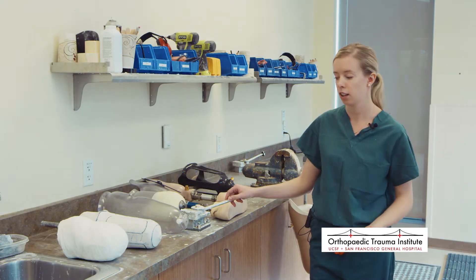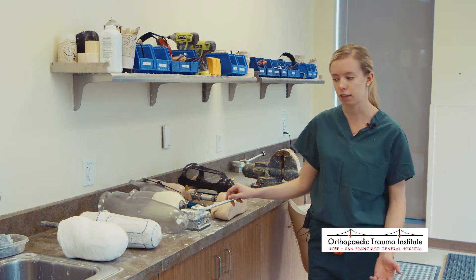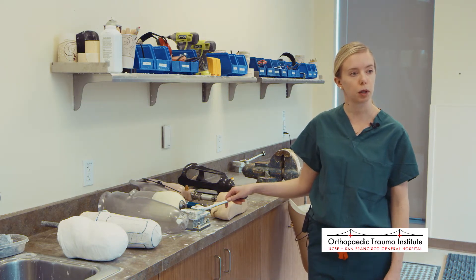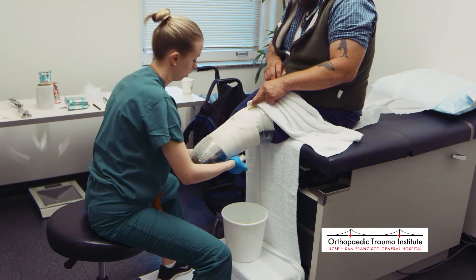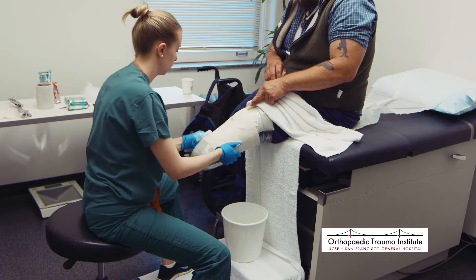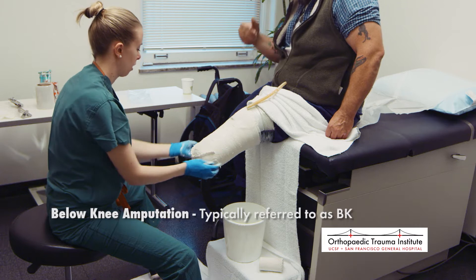In order to make a prosthesis, we have to first copy the leg or arm that's left — the residual limb, we call it. The process involves going through a casting: we use plaster, wrap it, and capture the shape of someone's leg. This is a cast of a below-knee amputee — this is what a cast looks like.